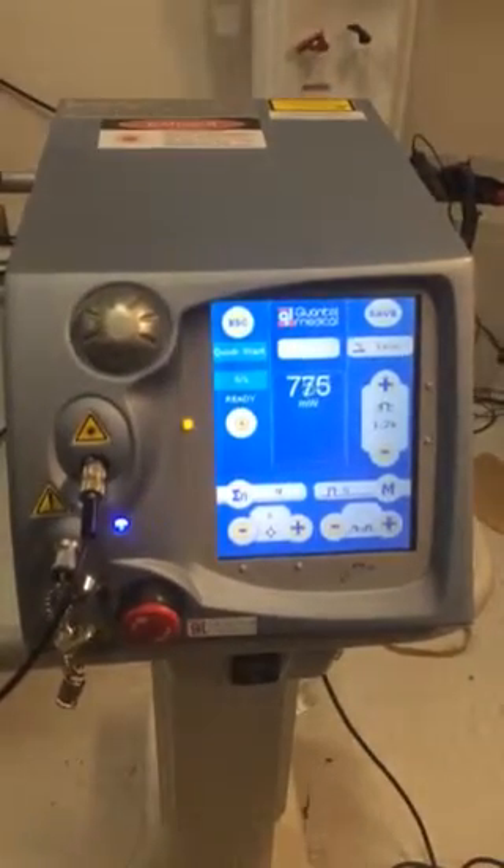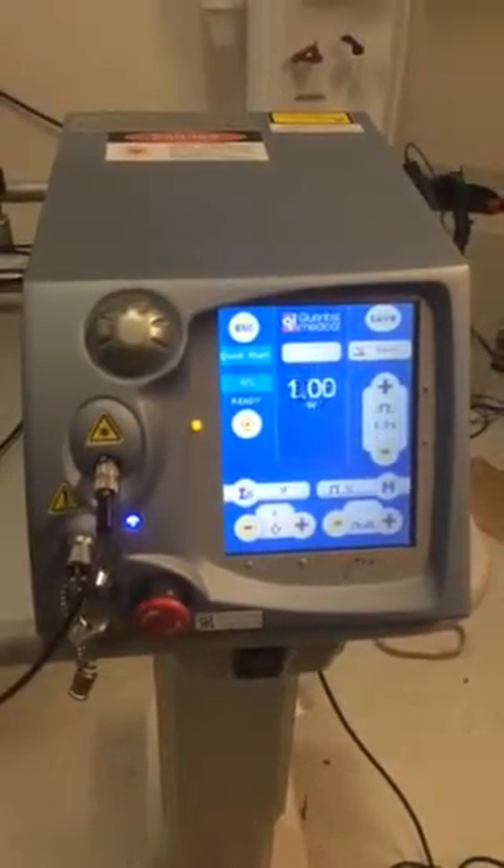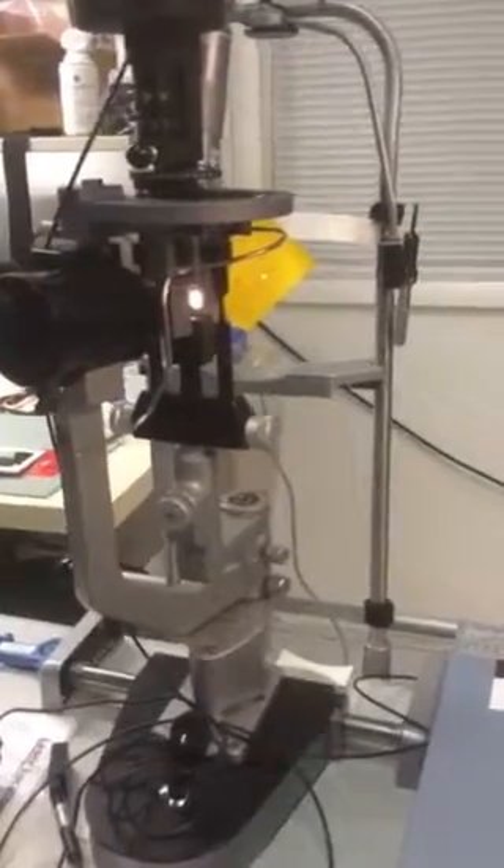I'm pressing this with my foot, and that's done with his foot. Great — one fire. That's gonna blind me. All right, that's good. And then the energy.